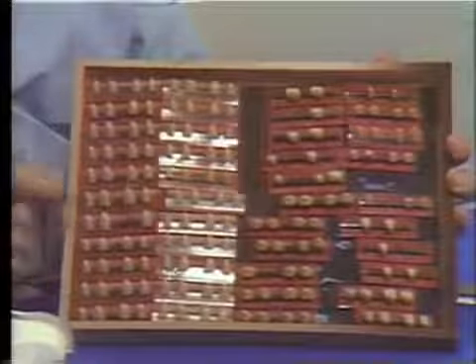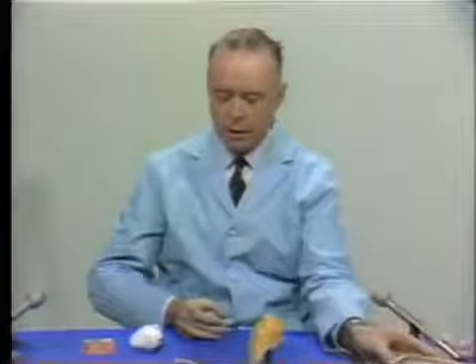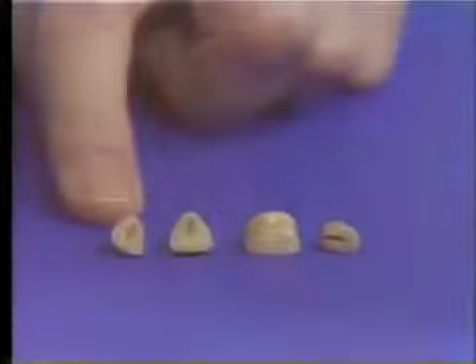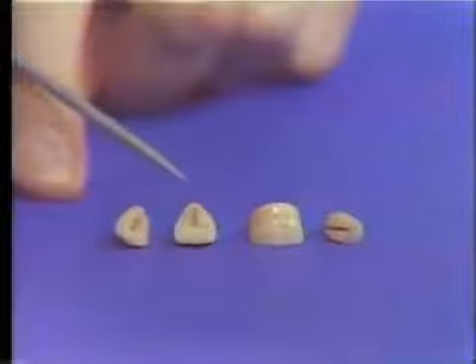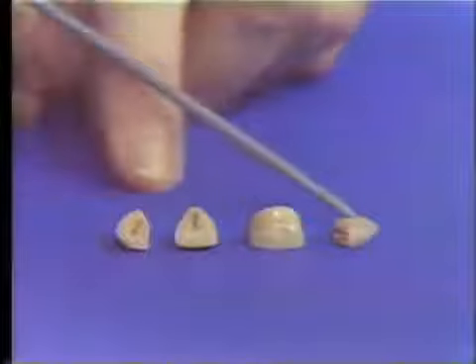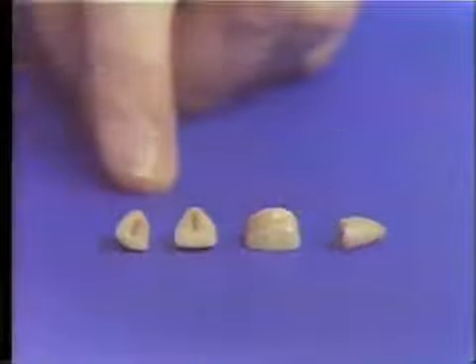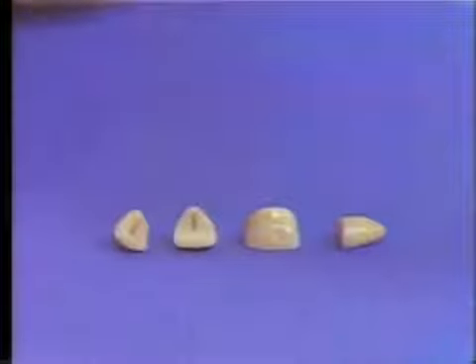In the full range of molds that are available for incisor teeth, bicuspids, and molars, and so on, these are selected in the usual manner. The code number is noted, and along with the shade, one can then order the facing which is required. A few of the different types can be seen here on the bench. This is one for a maxillary cuspid. Here's one for a maxillary incisor. This is a molar type facing, and this is a bicuspid facing here, the small, actual size model of the one that we were looking at previously.